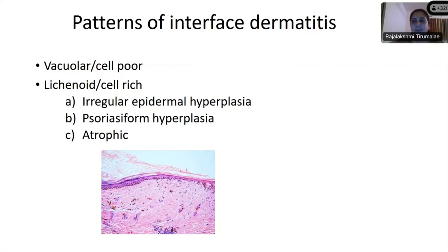I think just the sites of lichen planus as against psoriasis, they are flexor sites. So they are on the flexor aspects of wrists, forearms, and around the ankles, as well as on the dorsa of feet. These are the common sites that are biopsied. But theoretically, lichen planus can occur anywhere on the body, and individual lesions may be present anywhere. It can also occur in the mucosal sites. So we often get mucosal biopsies for lichen planus.